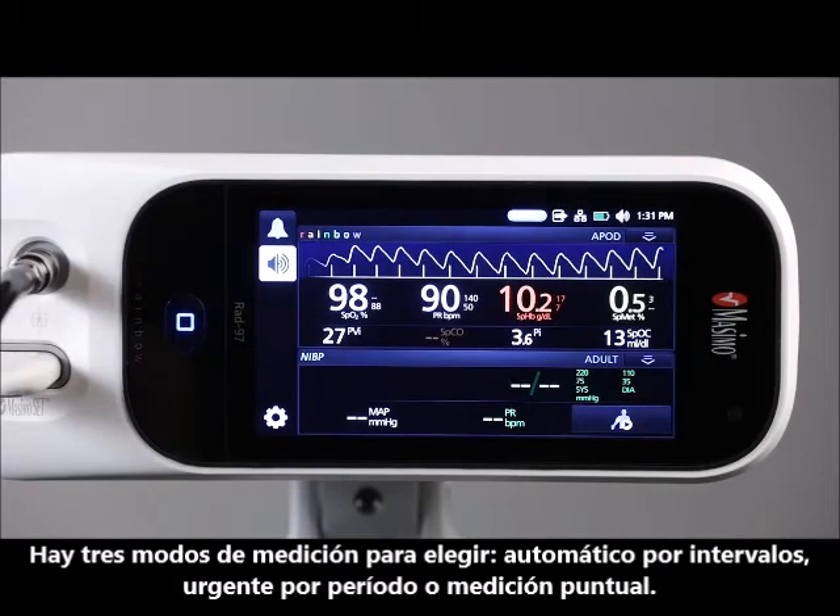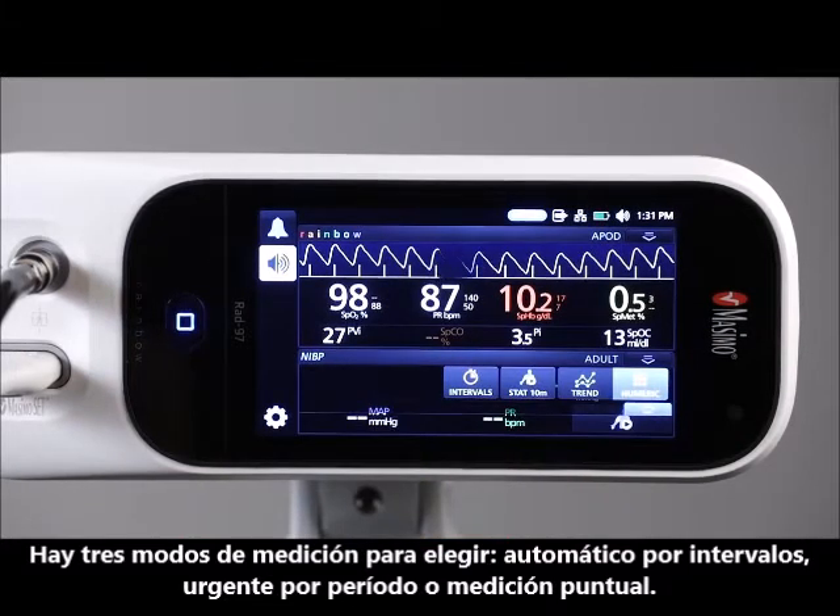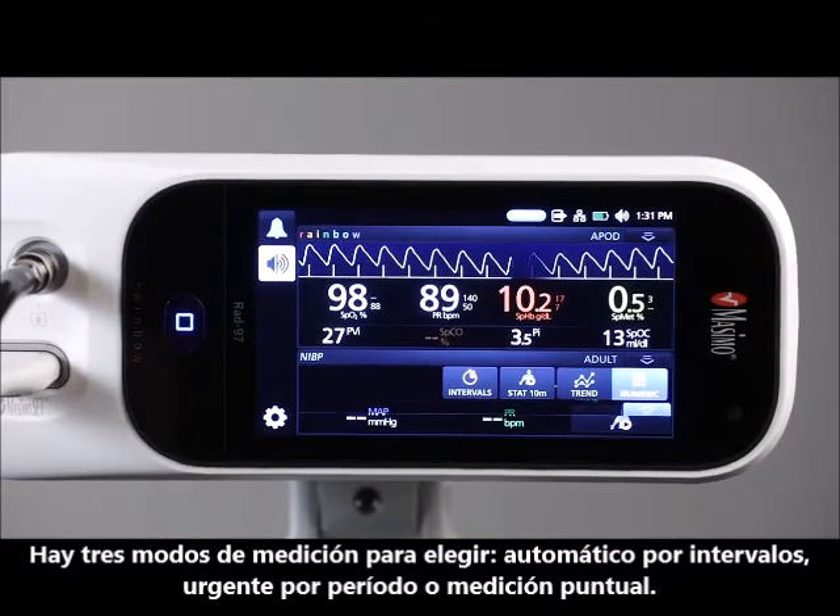There are three NIBP measurement modes to select from: Automatic Interval, STAT Interval, and Spot Check.